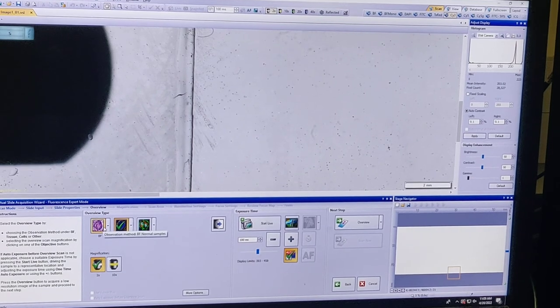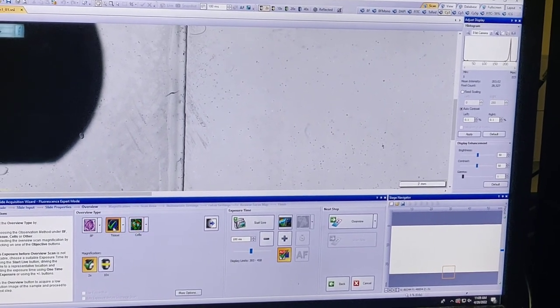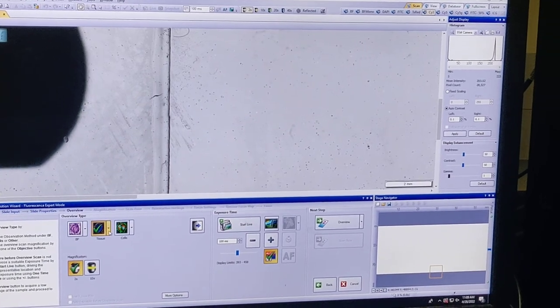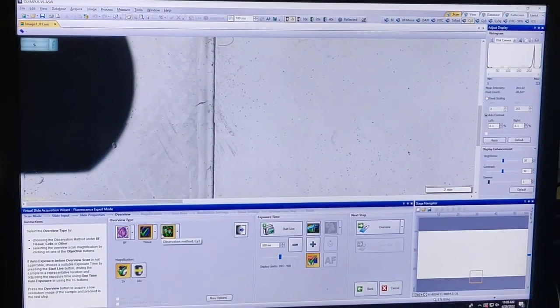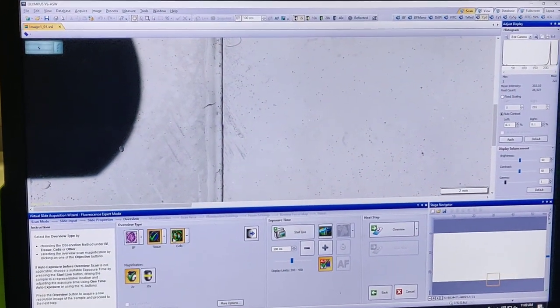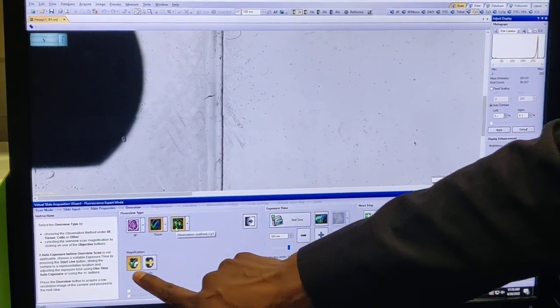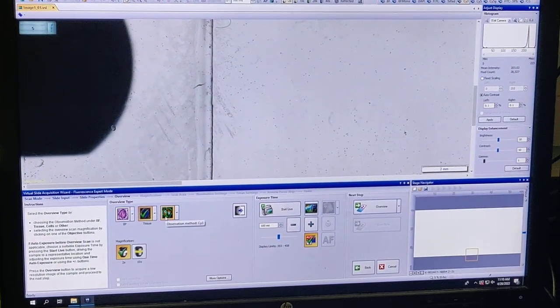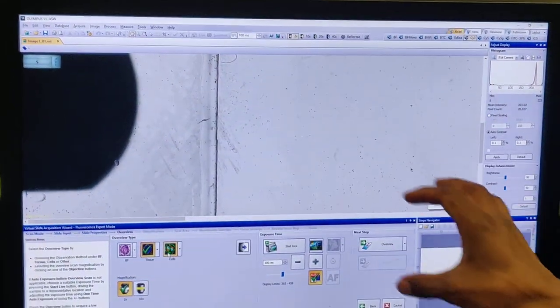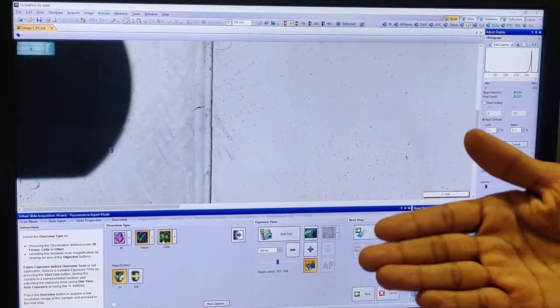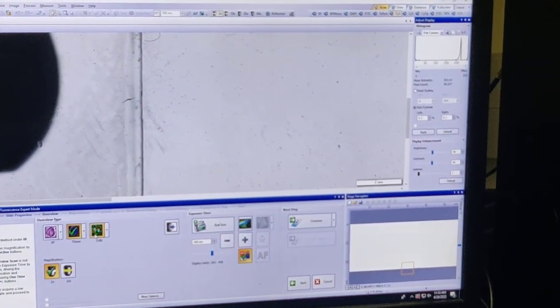There are multiple modes: bright field, and you can do tissue or cells. The difference is that tissue mode looks for larger objects and cells mode for smaller objects, though it won't matter much in practice. For overview, you can image at 2x or 10x. At 2x you'll image faster but with lower intensity; at 10x it will be brighter but take much longer. Choose accordingly.